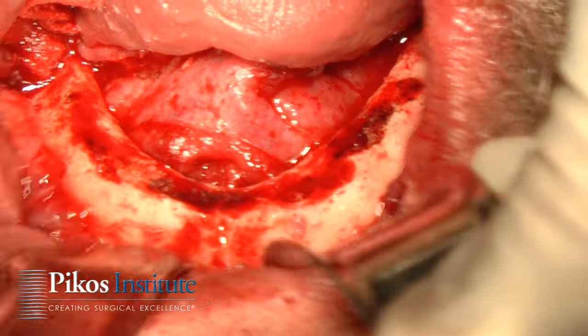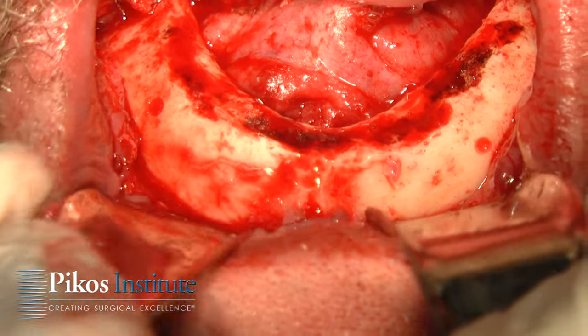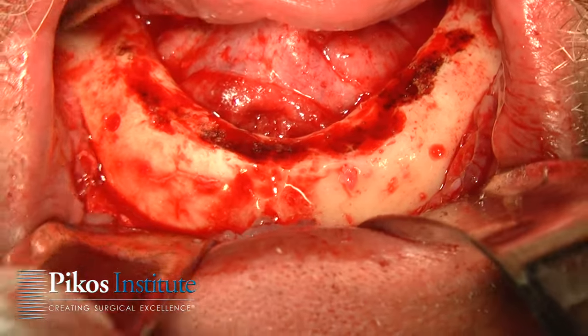Now I can just eyeball where this mark is and this mark, and I will equally space our four implants for the bar case.